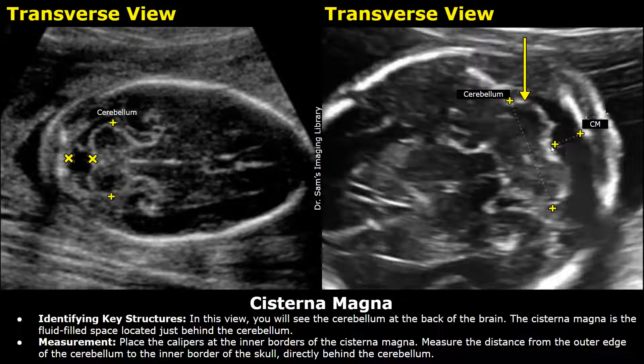Place the calipers at the inner borders of this anechoic space. Measure the distance from the outer edge of the cerebellum to the inner border of the skull directly behind the cerebellum, and you will get the measurement of the cisterna magna.